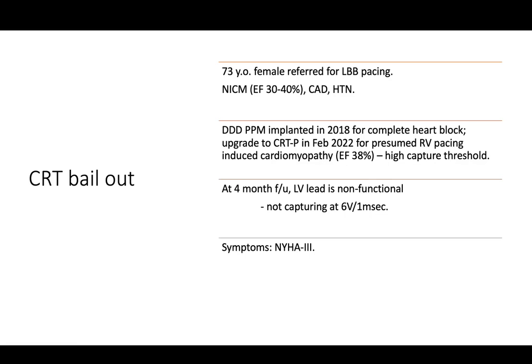That's really cool. I've never thought of moving V1 before. That's really nice. Yeah. You know, Vartan, I've been doing the opposite. I've been trying to go higher sometimes, to put the lead on top to see if I get the right bundle. I've never thought of going lower.